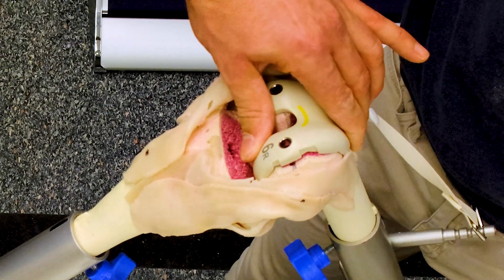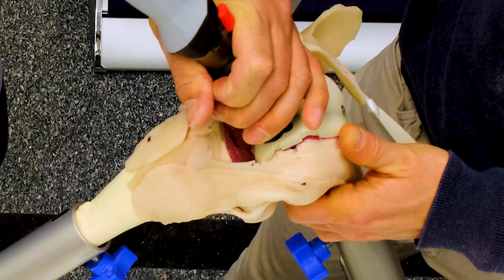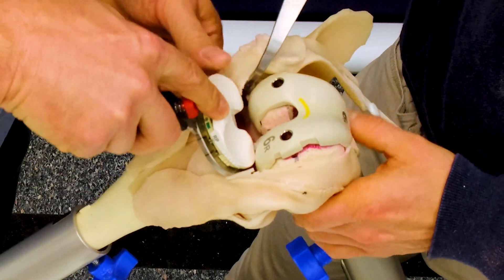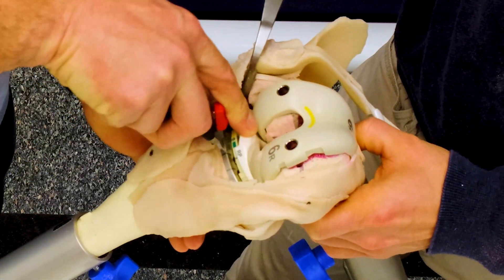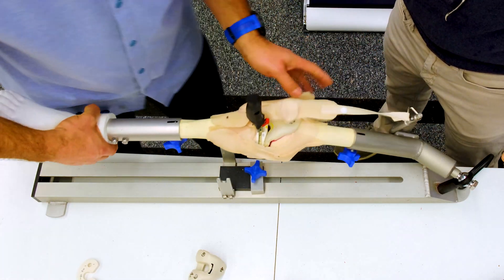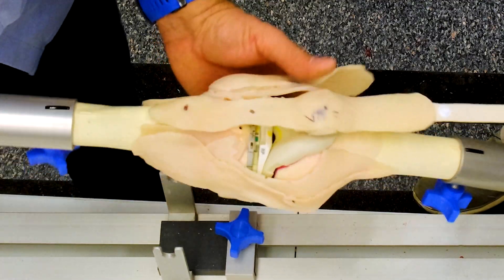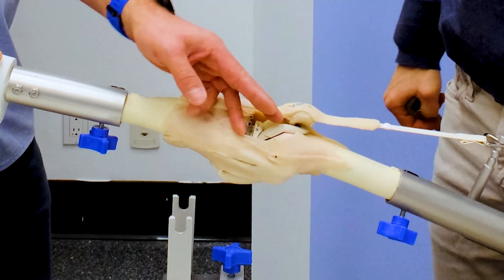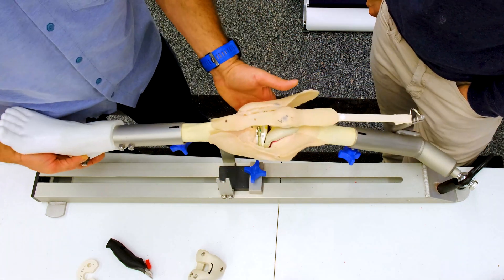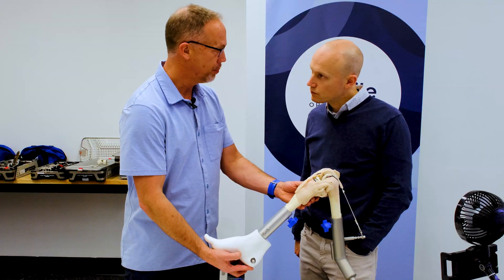Let me impact that and put the tibial tray back in. Now let's see if the trial looks any better. Right away our quadriceps angle looks better — the sulcus isn't medialized now. It sits where it needs to sit and it looks like the patella is tracking down the middle.